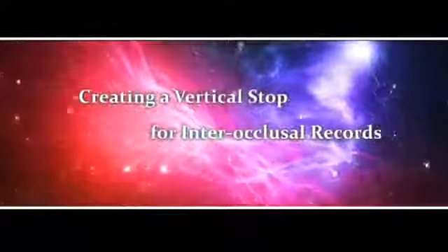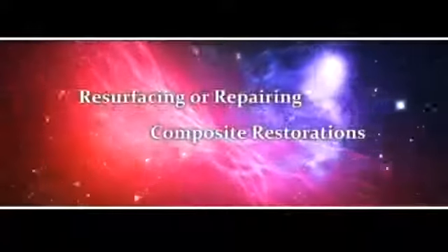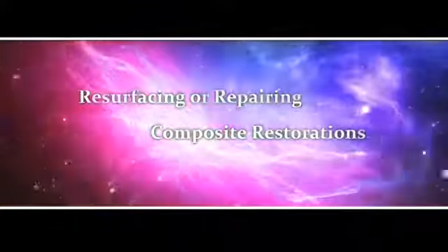Creating a vertical stop for interocclusal records. Flowable composite resin can be used as an accurate interocclusal record for the orientation of models for fixed prosthetic restoration. To resurface or repair composite restorations.